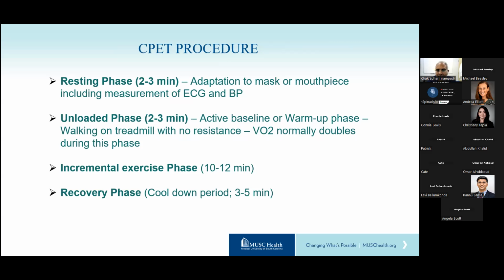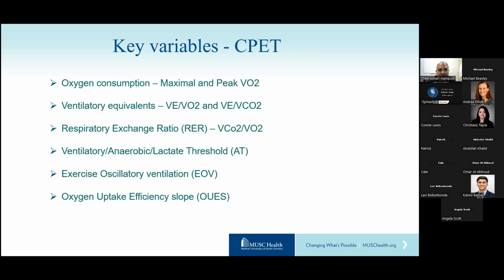But there's still some data that is helpful to understand the limitations the patients might have and to determine if the transplant is ideal for the patients. Some of the key variables measured are oxygen consumption.